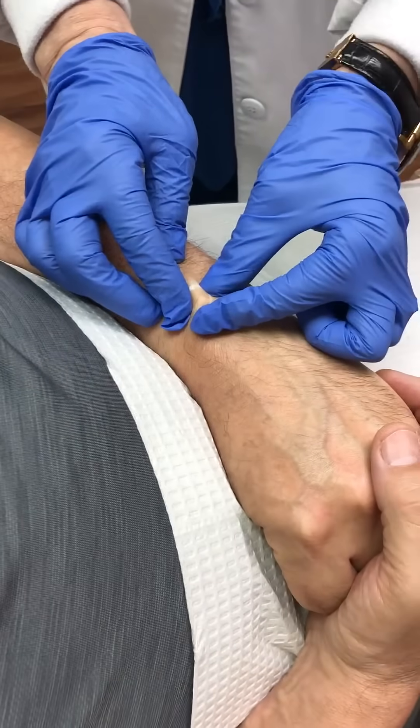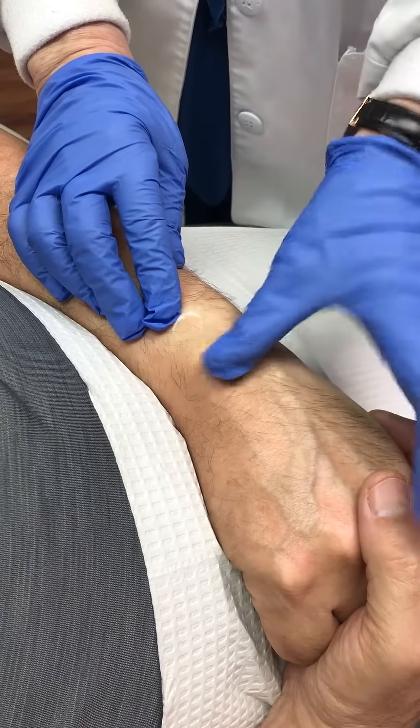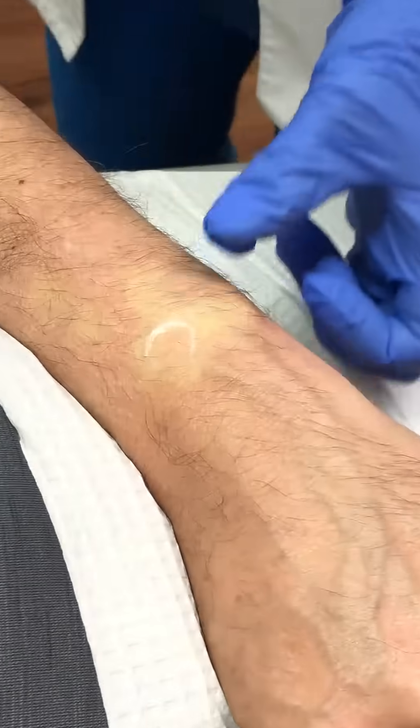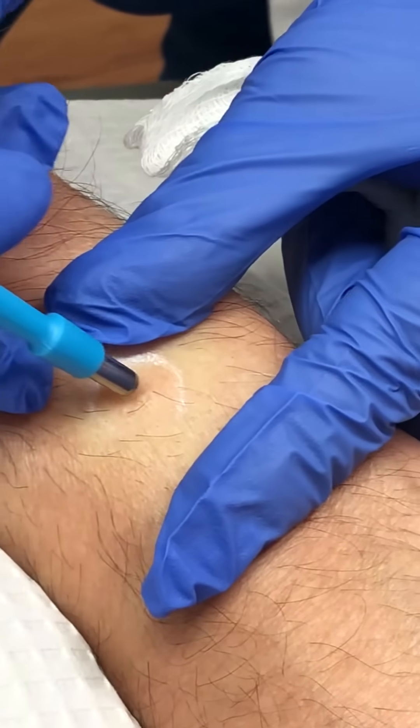This patient is here for evaluation of a lesion on the forearm near the wrist. We're going to take a little biopsy. You can visualize it here because it's already numb. Perhaps you cannot see it so well. So we're going to do a little punch biopsy. I'm going to show you the technique. It's already numb.